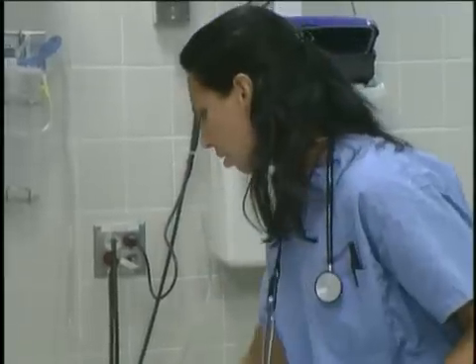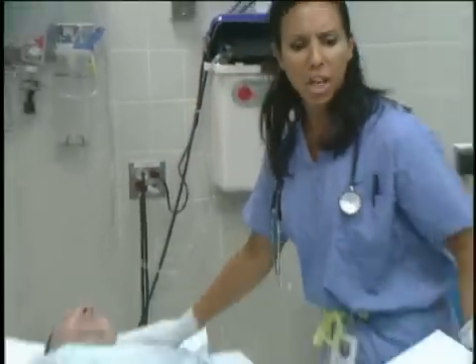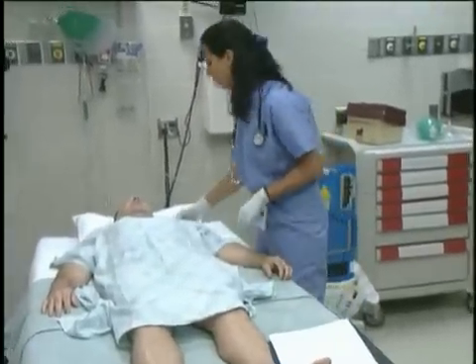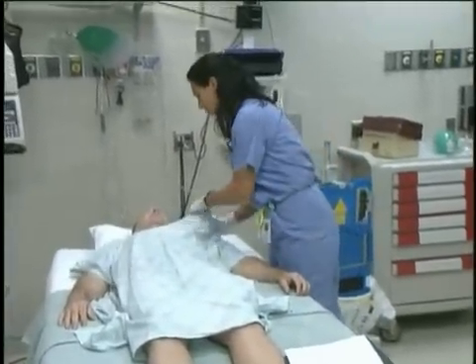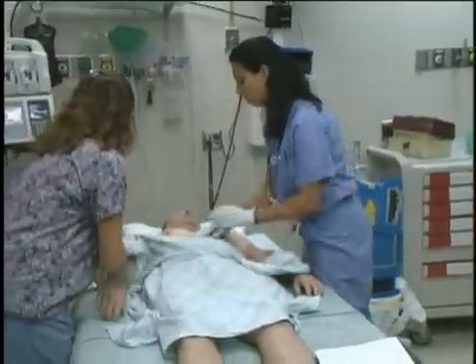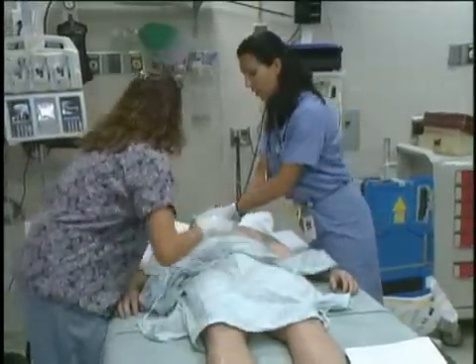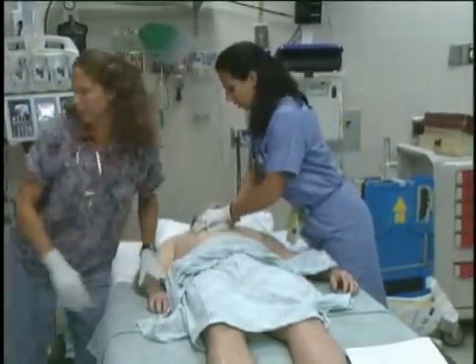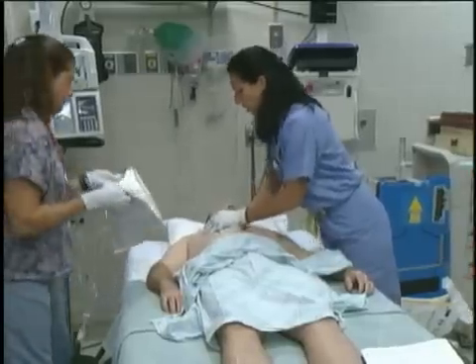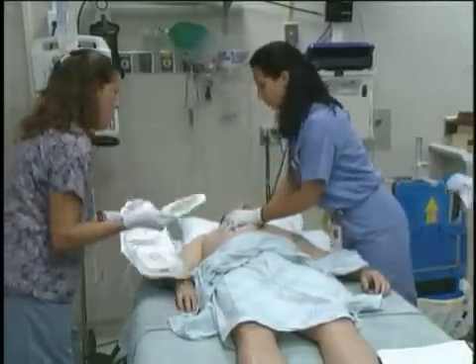Mr. Spinetti? He has no pulse. Jen, call a code. I need help in room three. Let me give you a hand. I'm going to start CPR. Can you get the defibrillation pads on? I don't know what happened, Jen. I was getting him signed up to go home, and I came in and he was getting blue.